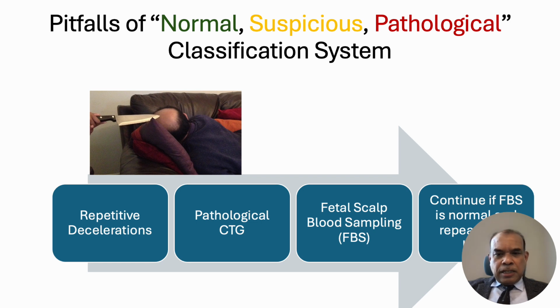Unfortunately, though Americans stopped using fetal blood sampling 30 years ago, there were 3 repetitive fetal blood sampling Cochrane systematic reviews stating clearly that fetal blood sampling did not improve perinatal outcomes or decrease emergency cesarean section.